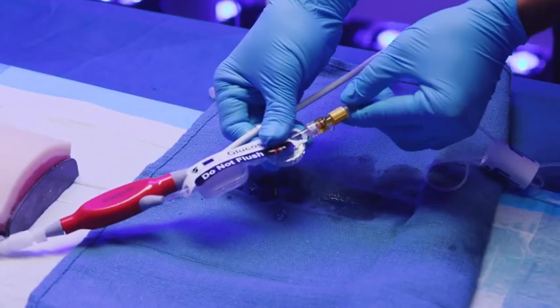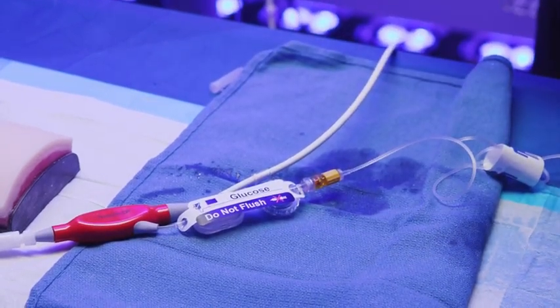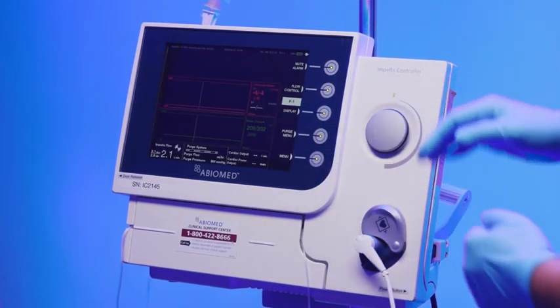Connect the yellow lure on the purge tubing to the yellow lure on the Impella catheter using a wet-to-wet connection. The change purge fluid procedure is now complete. Press done to exit the purge wizard.